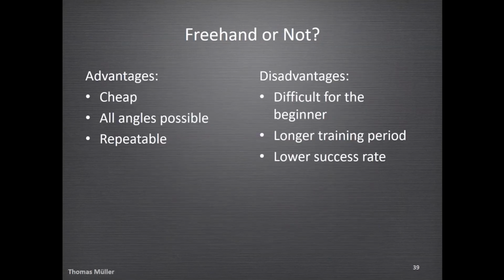Freehand or not is one of the questions which ultrasoundologists can have a long debate on. The advantages of the freehand technique, which I showed you in the beginning, one hand the transducer, one hand the needle, in plane technique, is it is very cheap. All angles are possible. It is repeatable endlessly. The disadvantage is it is a little bit difficult to learn for the beginner.